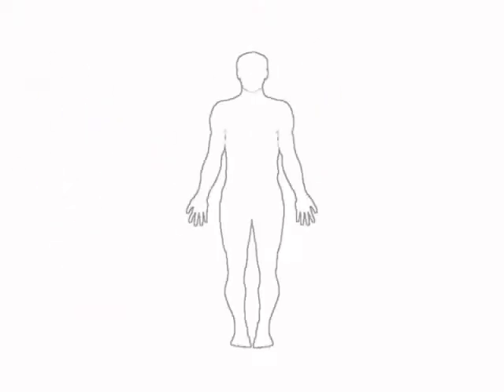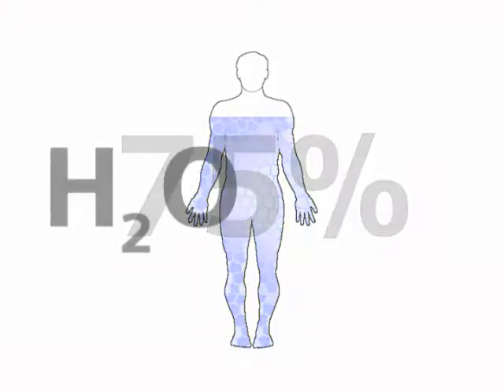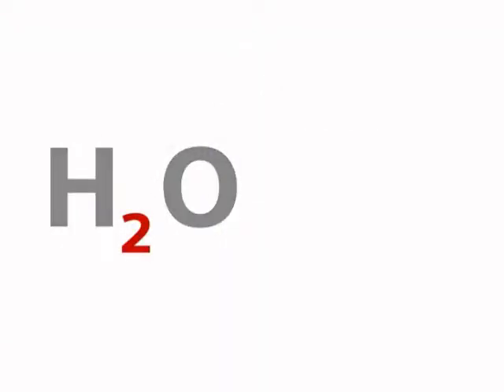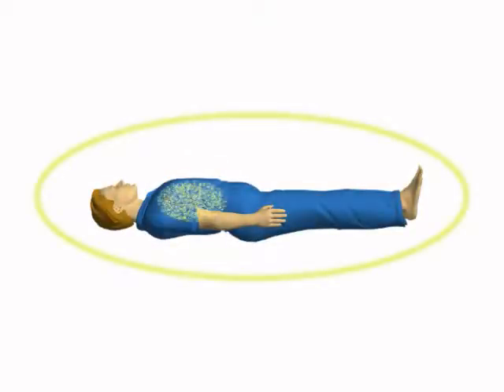As you know, the body is made up of approximately 75% water. Water is 2 parts hydrogen, making the nucleus of the hydrogen atom, the proton, the most abundant in the human body. A radio wave is then used to excite the proton, which resonate and emit varying signals which are received, digitized, and displayed as images.